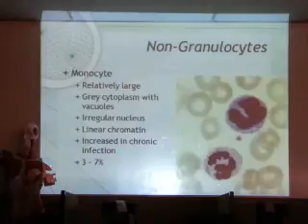Chromatin pattern, if you can actually see it under a microscope, can we just use the microscope here? Mm-hmm. Oh, okay. If you see monocytes on the microscope, the chromatin pattern tends to be a lot more delicate looking. We call it streaky, linear chromatin arrangements, very delicate looking.